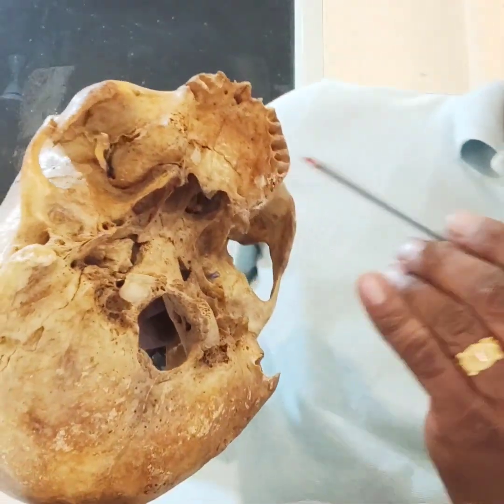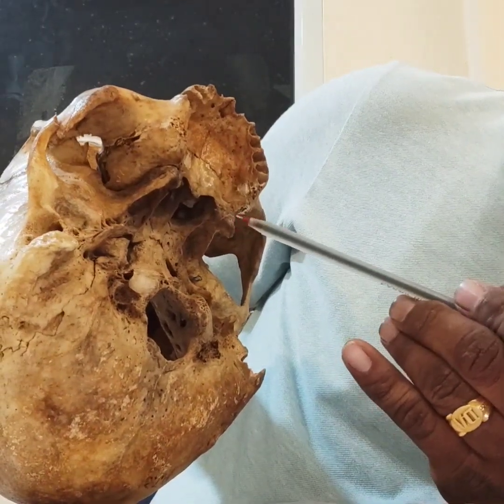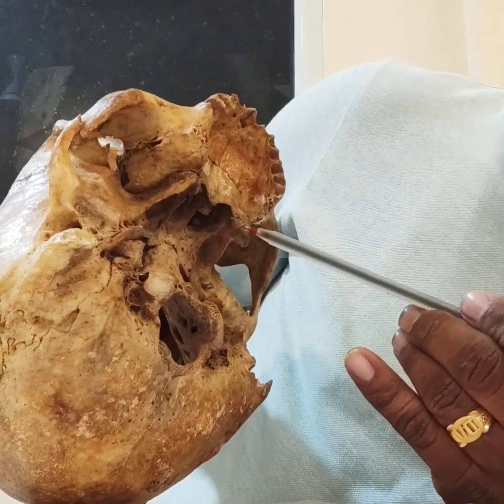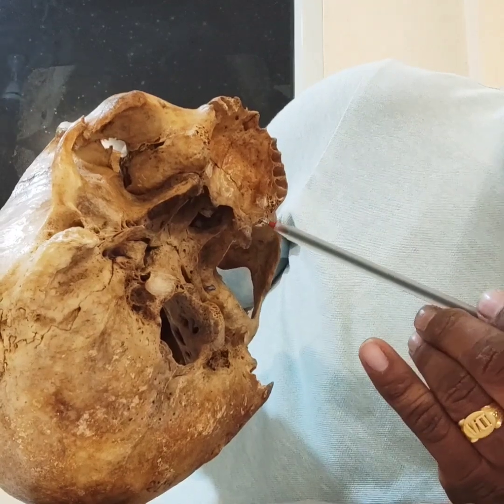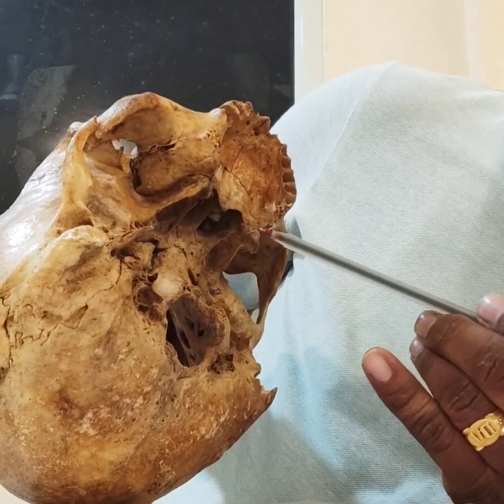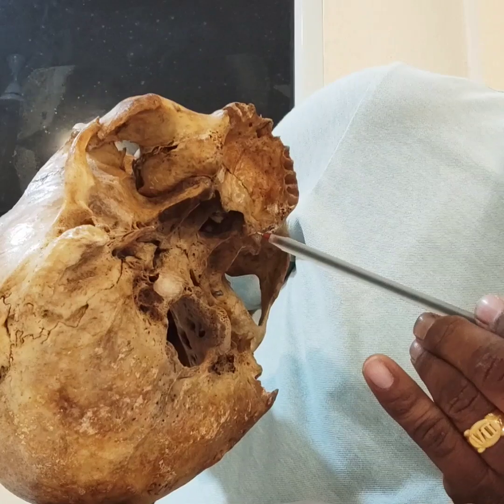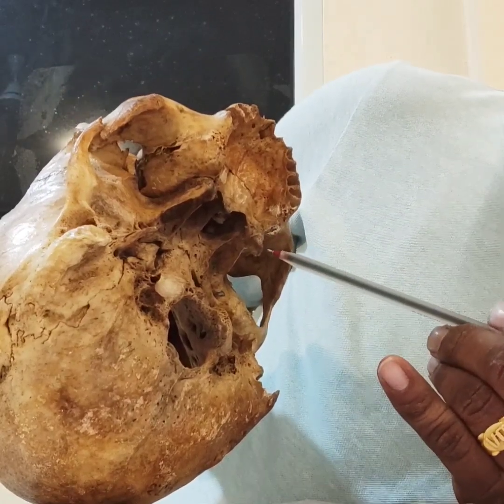The fusion zone is the area where you are going to engage the implant, that is between the medial and the lateral pterygoid. This fusion zone, usually you have to locate this mineralized bone through a tactile approach. Tactile approach means you have to start the osteotomy, feel the bone with any kind of pathfinder instrument, then proceed further with the osteotomy. You have to engage the implant in the fusion zone area between the lateral and the medial pterygoid.